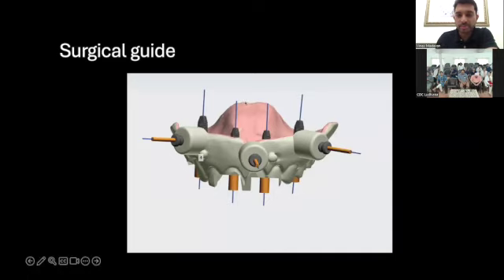But this is what I was talking about. If you feel like the tissue is not adapted properly in your immediate or interim denture, you want to reline it before you obtain a scan, because if the tissue is not adapted properly to the underlying denture, then your guide is not going to be accurate. So all the planning that you did, you might have some inaccuracies.